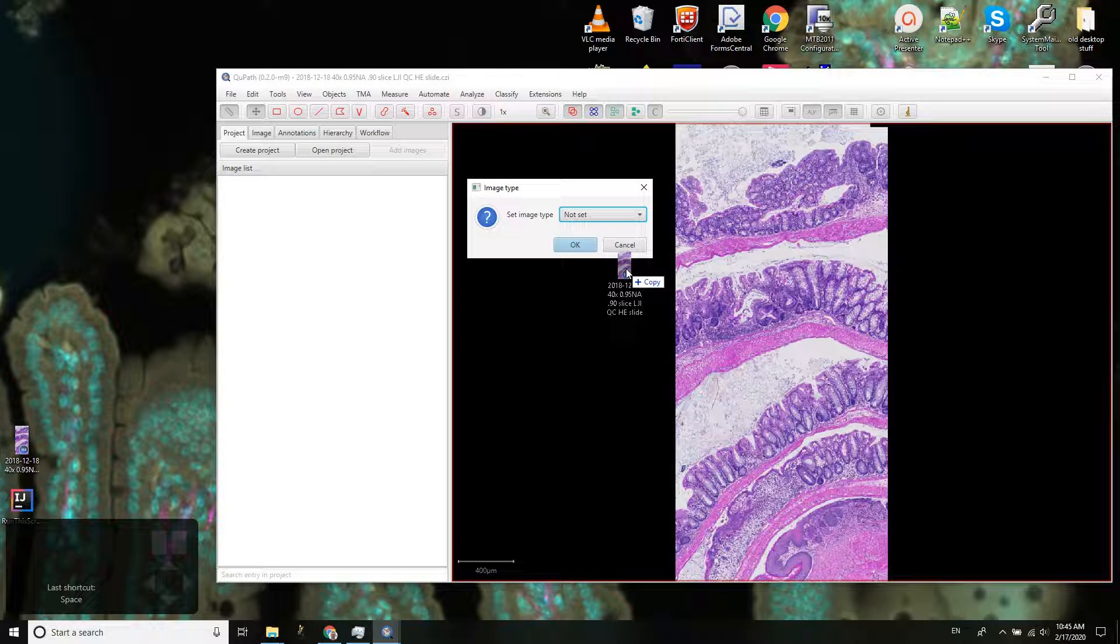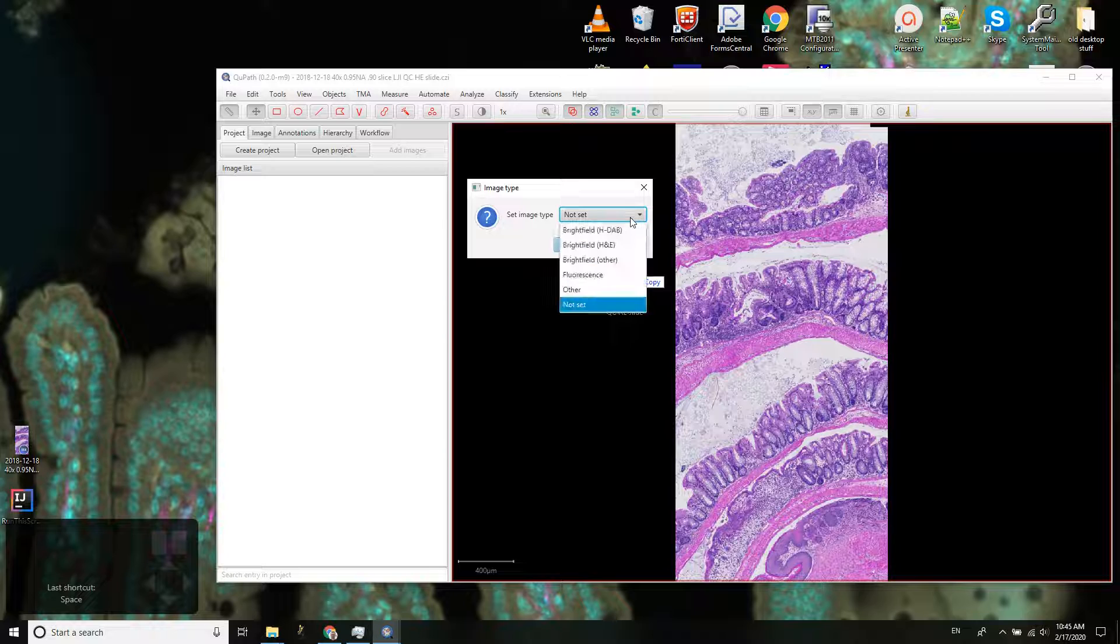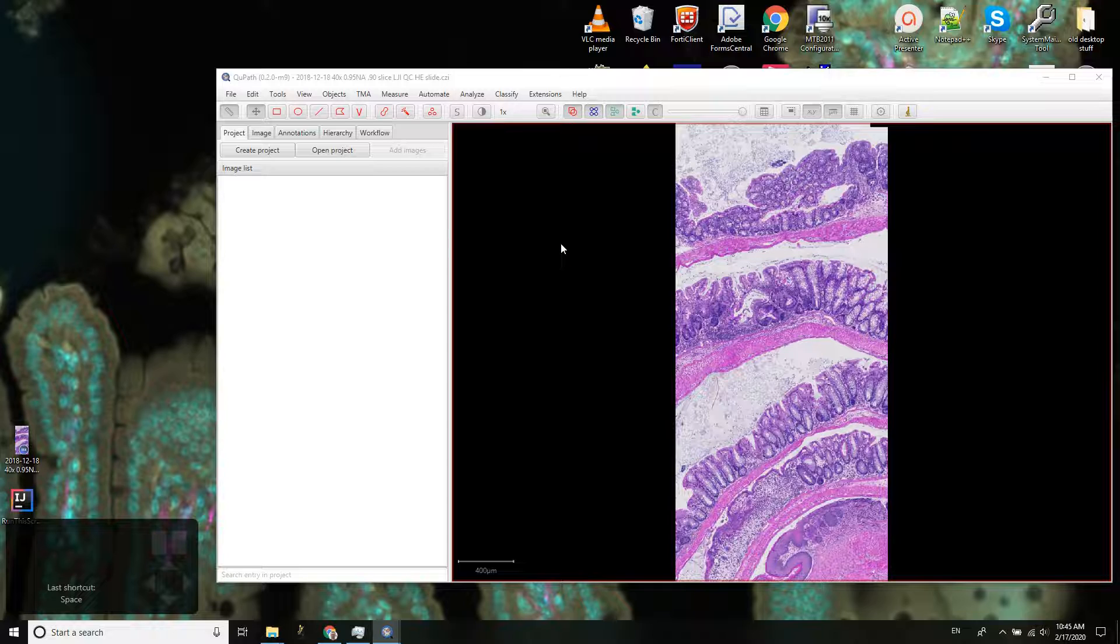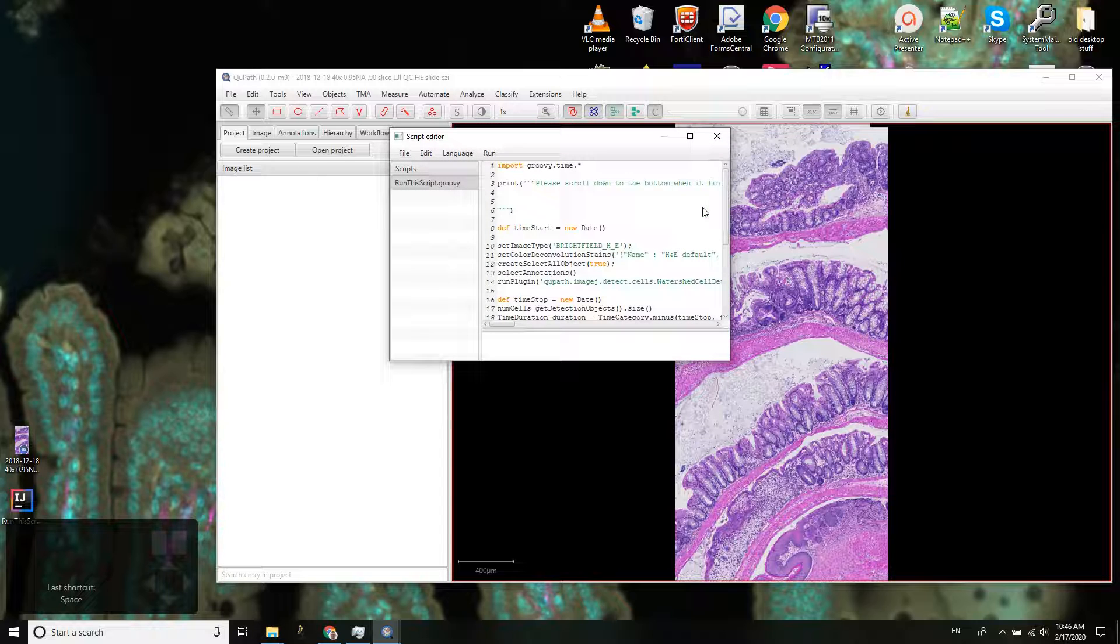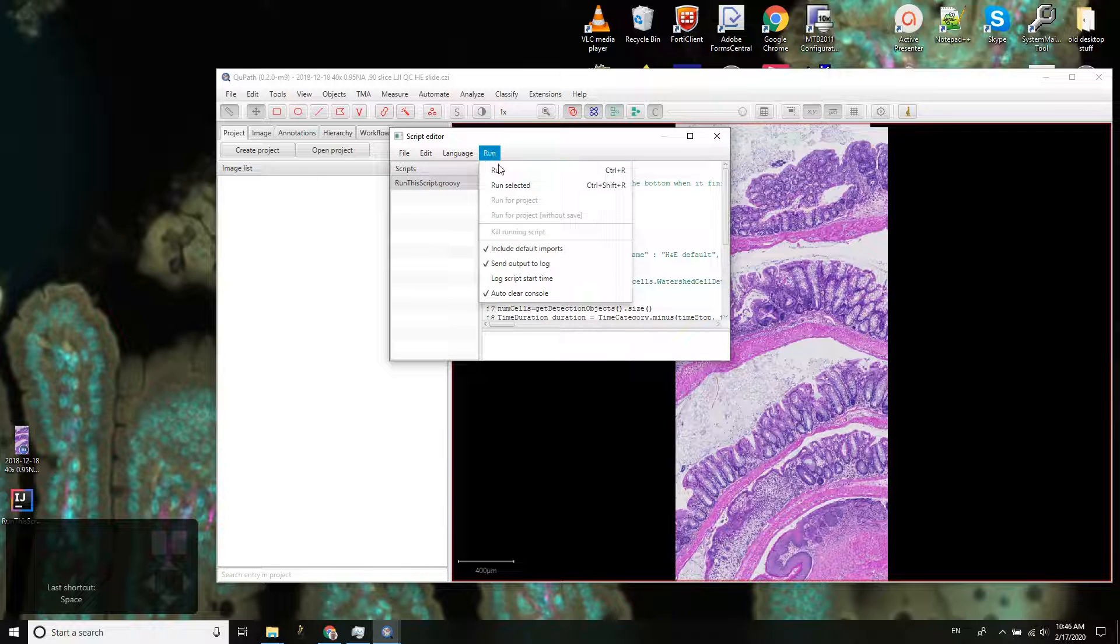And QuPath asks me what image type it is. I will say this is an H&E. And then I'm going to drag the script over, drop it in here, and then go run and run.